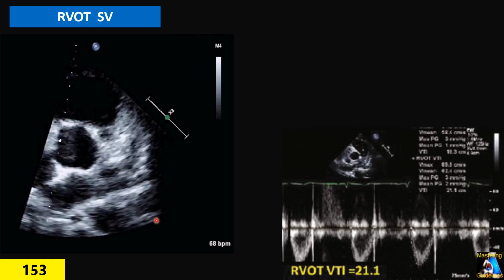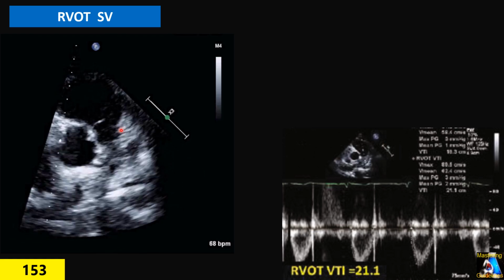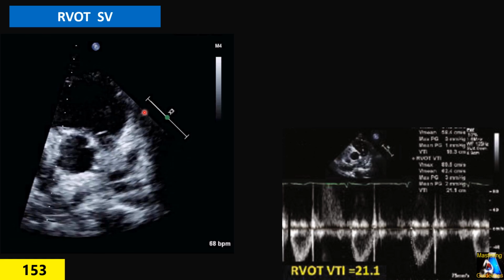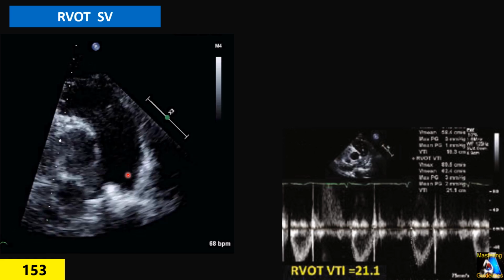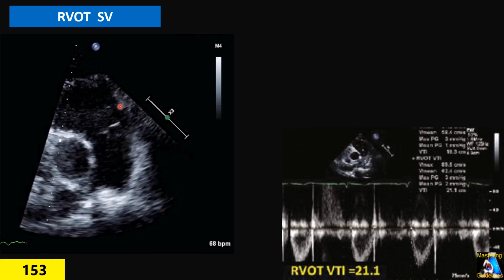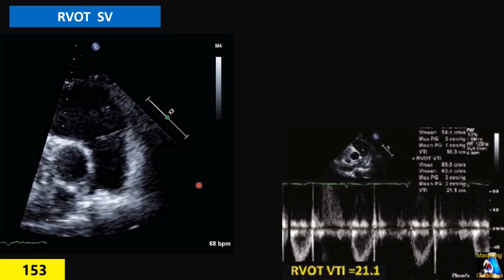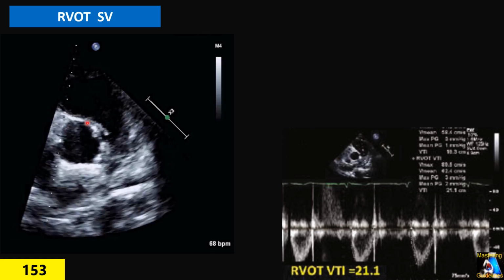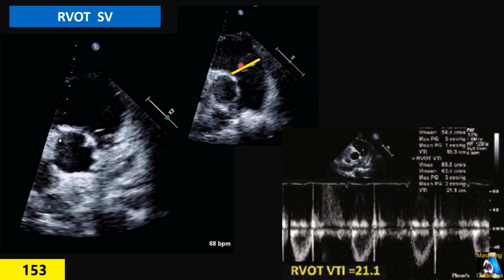For that purpose, we go PSAX, at the aortic valve level. When you get that, we twist a little more clockwise. We open the pulmonary artery and make sure we can clearly see the pulmonary valve ring, as you can see here. If we twist a little more clockwise, you can even see the bifurcation of the pulmonary artery. When you have that, you pause it, go through the loop, and during mid-systole or end-systole, whichever has the highest diameter at the pulmonary valve ring, you measure the diameter.